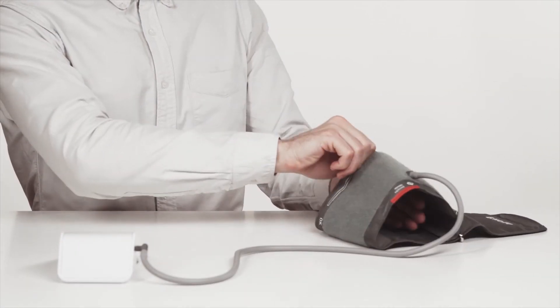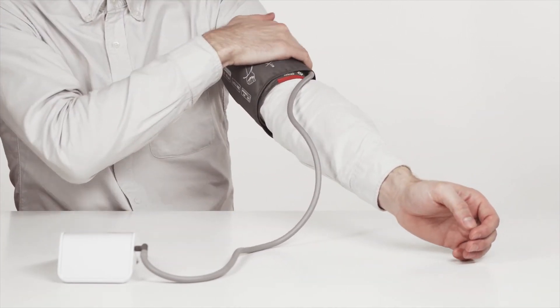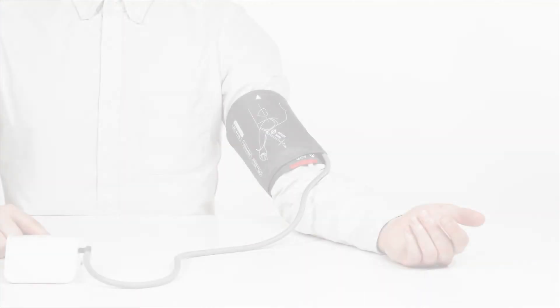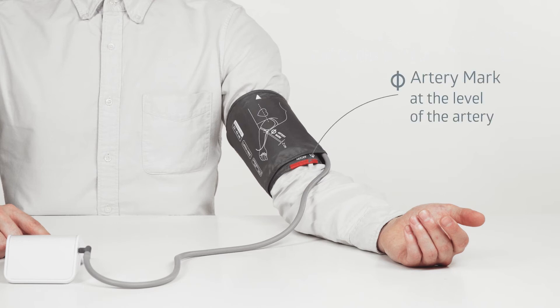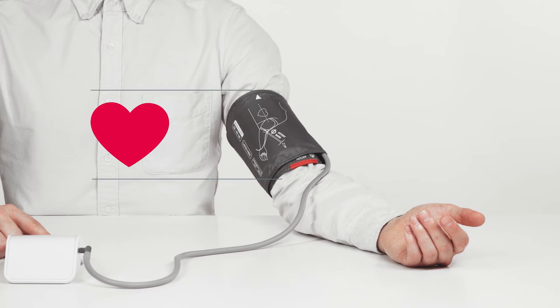You can easily put on the Be Well cuff on your own. Insert your arm into the cuff and secure it, but not too tightly. The lower end of the cuff should be one to two centimeters above the bend of the elbow. The special mark should be directly over the artery. When taking measurements, the cuff must be at heart level.